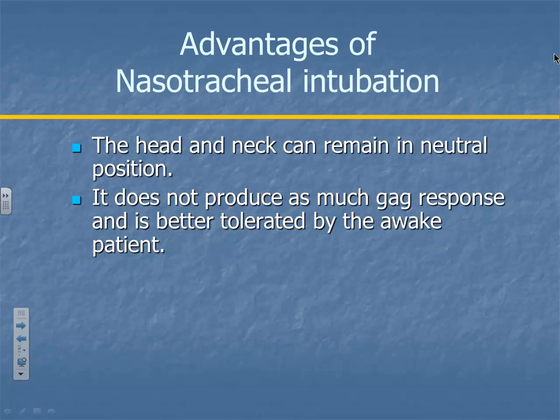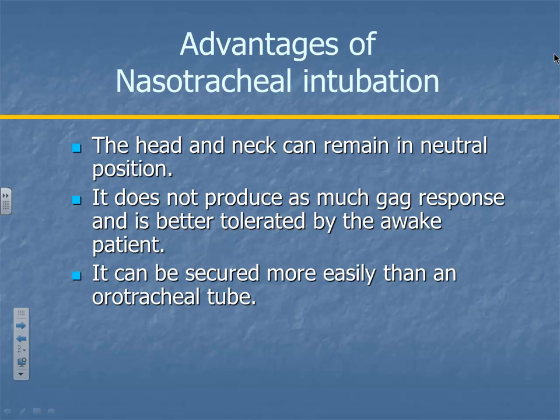If your patient is breathing but they're not solidly unconscious, you try to go in through the mouth and they have a gag reflex. So with the nasal intubation, you have a less likely chance of a gag reflex. And then if they wake up, it's not as bad as if you've got one in the nose as if you've got it blocking your airway, or so they think.